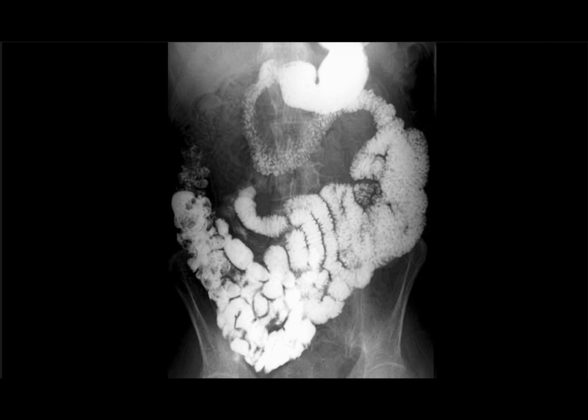In barium enema, the route of administration is different because in that case, the contrast is inserted through the rectum, through the anal region. Okay? For a barium enema, the patient does not drink the contrast. The contrast is inserted through the anal region, and then the barium enema is done to visualize the colon. So that's the difference between a barium follow-through and a barium enema.